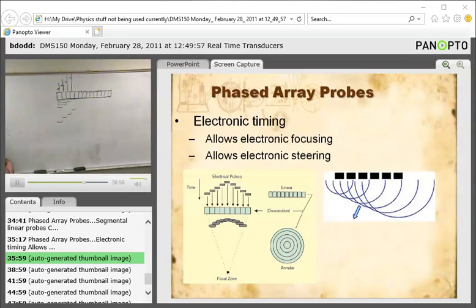If you use Huygens principle now, you can draw what this wave is doing. It's a wave like that. So now we have a wave at an angle. Waves like to travel in the direction of their wavefront. So here is the wavefront. This wave is actually going to travel in that direction. So what we've done is we fired off some little wavelets. They make a big wave, and that wave is now steered in a particular direction.